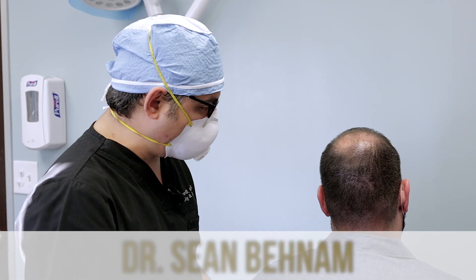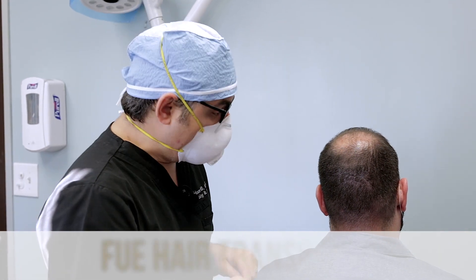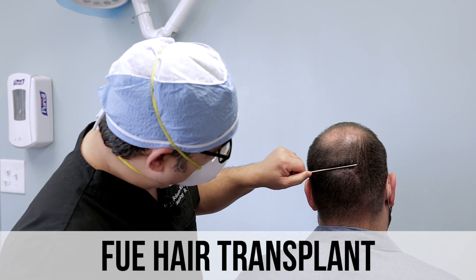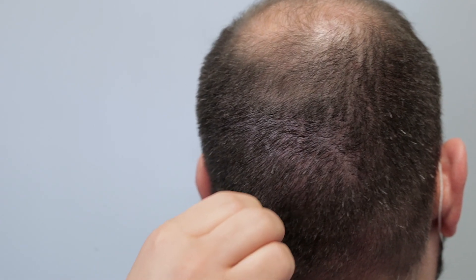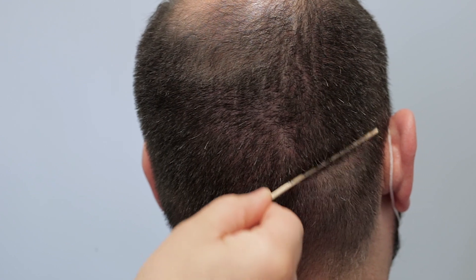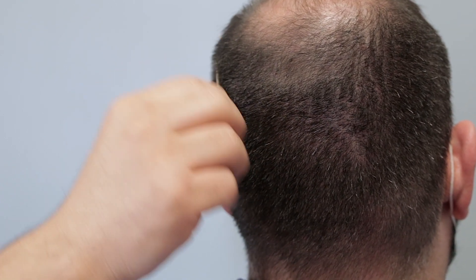Dr. Sean here. I'm joined with my patient who we did a prior FUE hair transplant — we got over 2,500 grafts FUE. This is the back of the scalp, just a month and a half out, and you can see it has healed really nicely. He wears his hair at number two and you can barely even see the scars. The punches are very small, and the benefit of using growth factors for healing is really amazing.